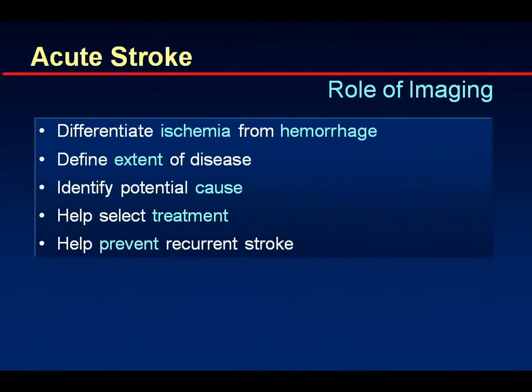It also helps you define the extent of the disease, may identify the potential cause, select the treatment, and help prevent recurrent stroke by, for example, looking at carotid stenosis and making it possible to treat this.